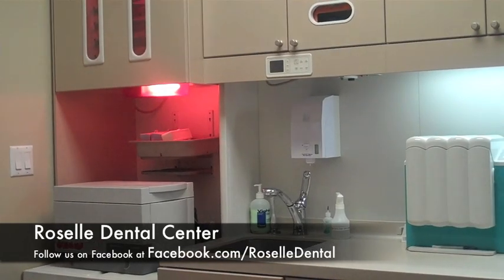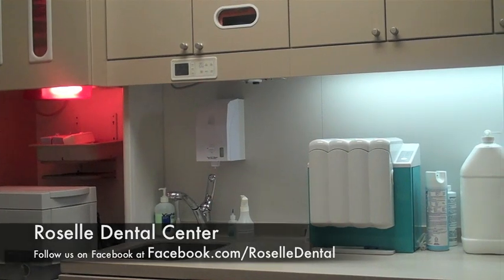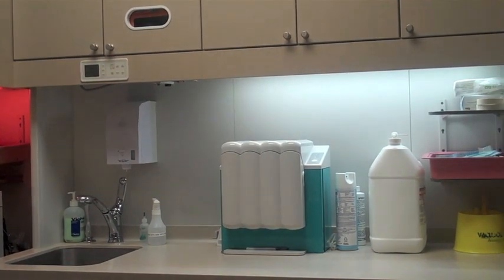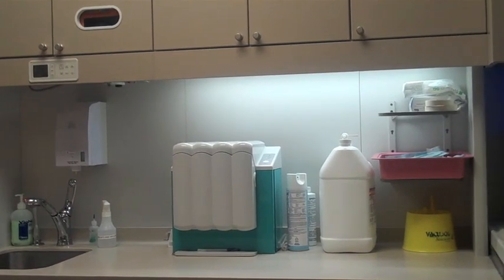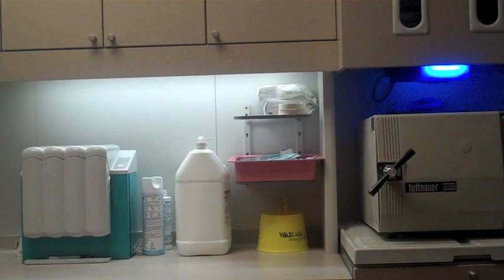This is the sterilization center here at Roselle Dental, where we clean and sterilize all our instruments for patient use. We are proud of the fact that we either meet or exceed the standards set by the CDC guidelines and OSHA. Let's take a look at the steps we take when we process and clean these instruments.